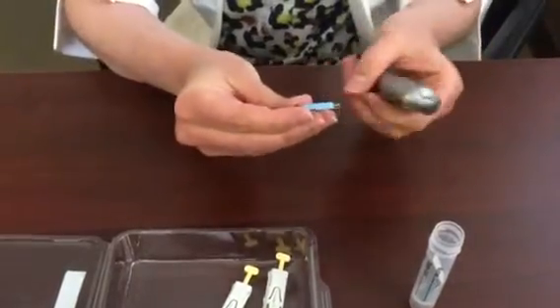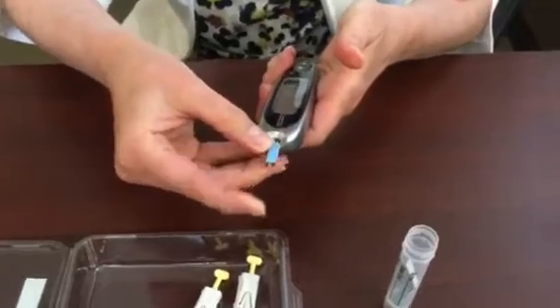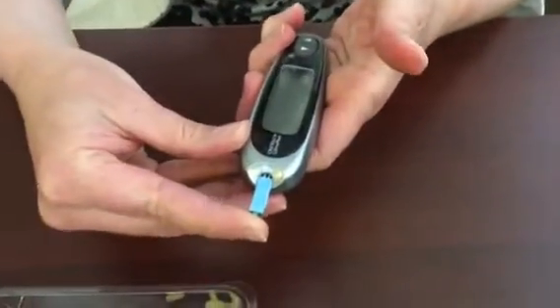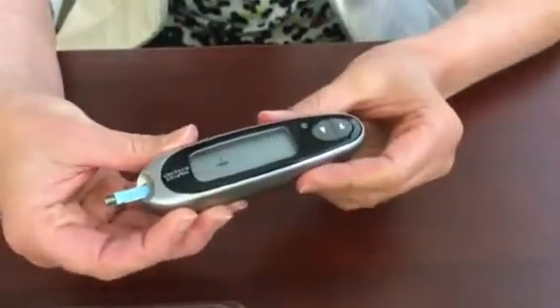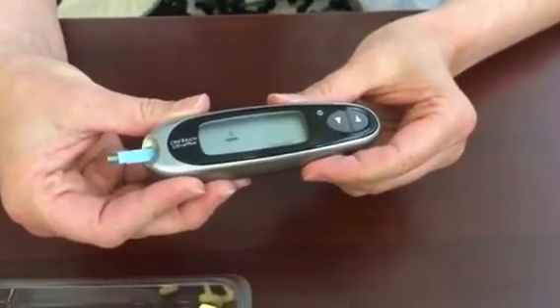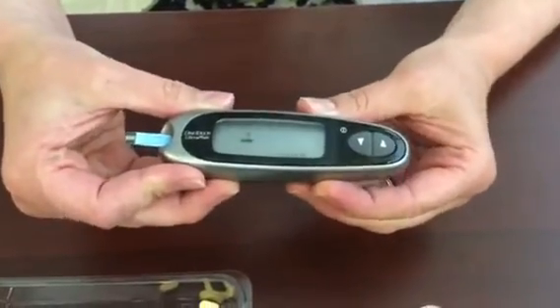Here's the little hole. We turn it so the white and black part of the test strip goes into the machine and we push it until it won't go any farther, which turns on the machine and gives us a little flashing drop, which means it's ready to test our blood sugar.